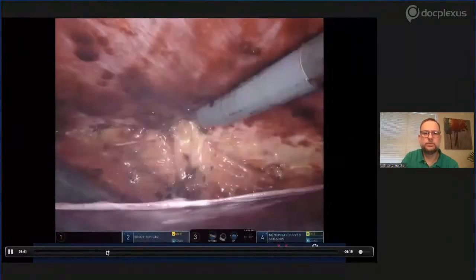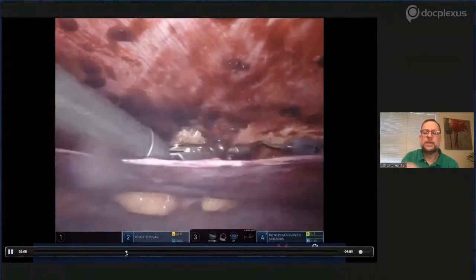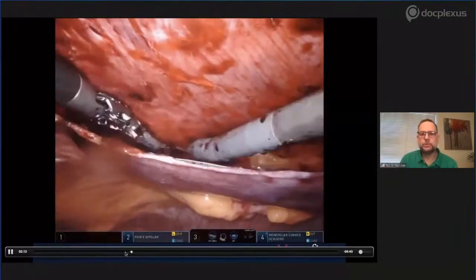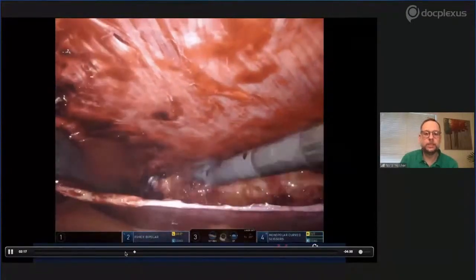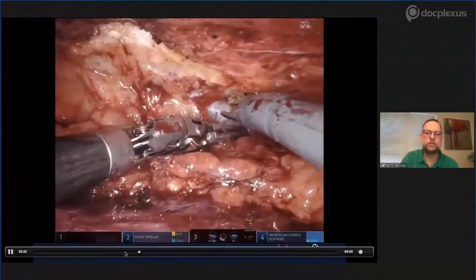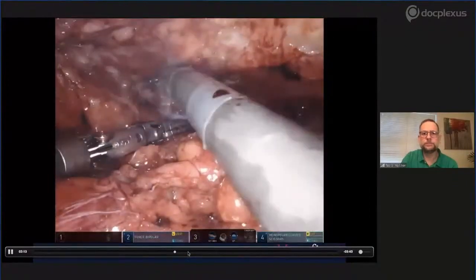It was a pretty small, 2 centimeter umbilical recurrent hernia. So dissecting, reducing all the content. Now my second space that will be hard is my contralateral side. I use the ruler all the time in my procedures. I want to be cautious that my space will be big enough, but not too big. So I measure myself all the time. Now it will start to get more difficult as I'm reaching the contralateral thin peritoneal area. But little by little, you create your space, pushing up the wall, buzzing: retract, buzz, push.